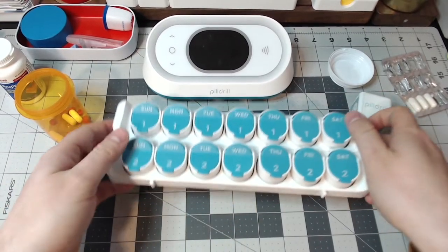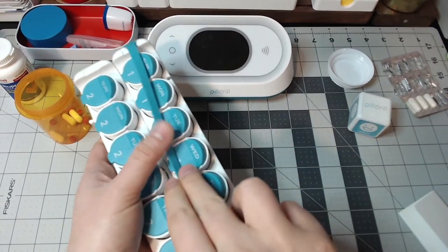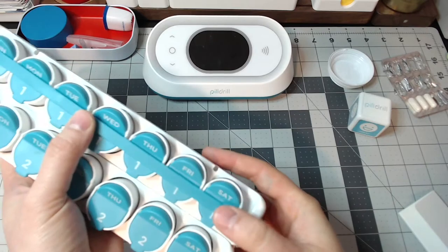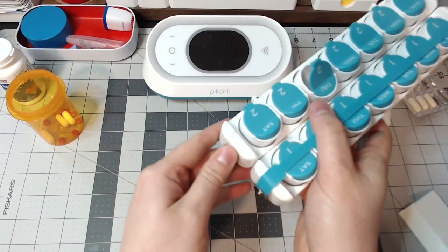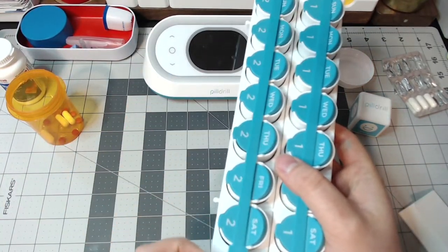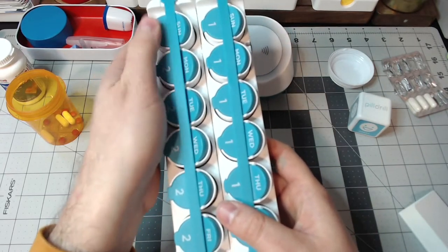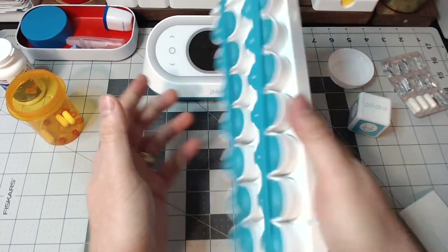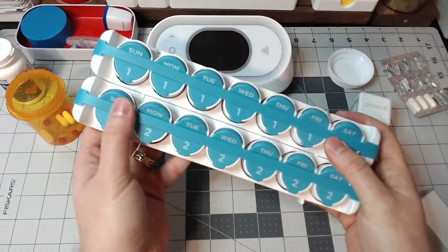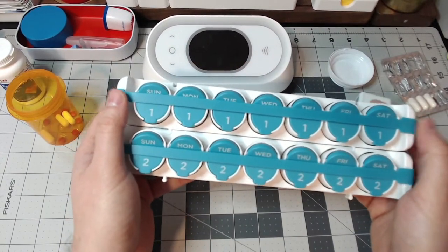One cool feature I thought about is that you can actually take this and fold it like that. They have little magnets down here, so you can actually do that — pop up the magnet, drag over the top, and now you can travel with it. So that's kind of cool. If you were traveling away, you could still take your medications with it. It's kind of a travel-friendly feature, because people aren't always going to be at home.